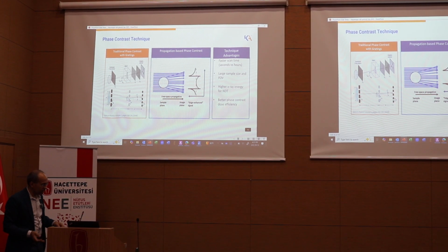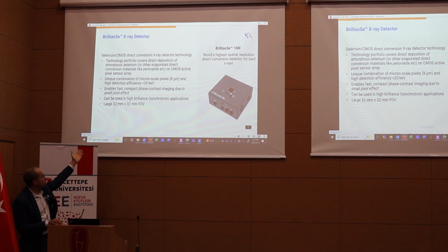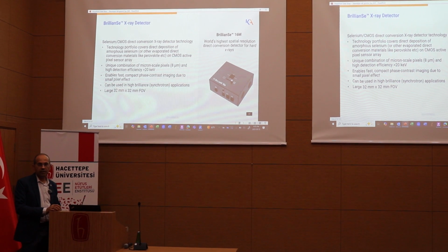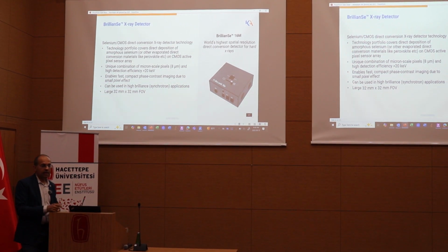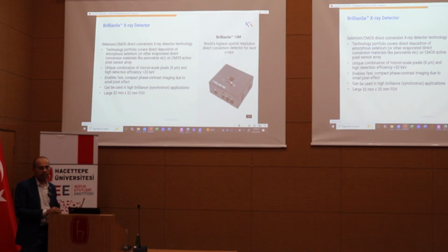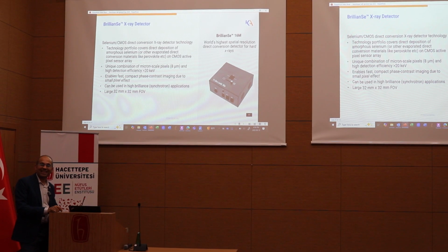So that's where we come along, and we created what I think still is the world's highest spatial resolution X-ray detector. It is an 8 micron direct conversion pixel with selenium, which I'm very pleased to hear that Ahmed is going to be bringing to this university.